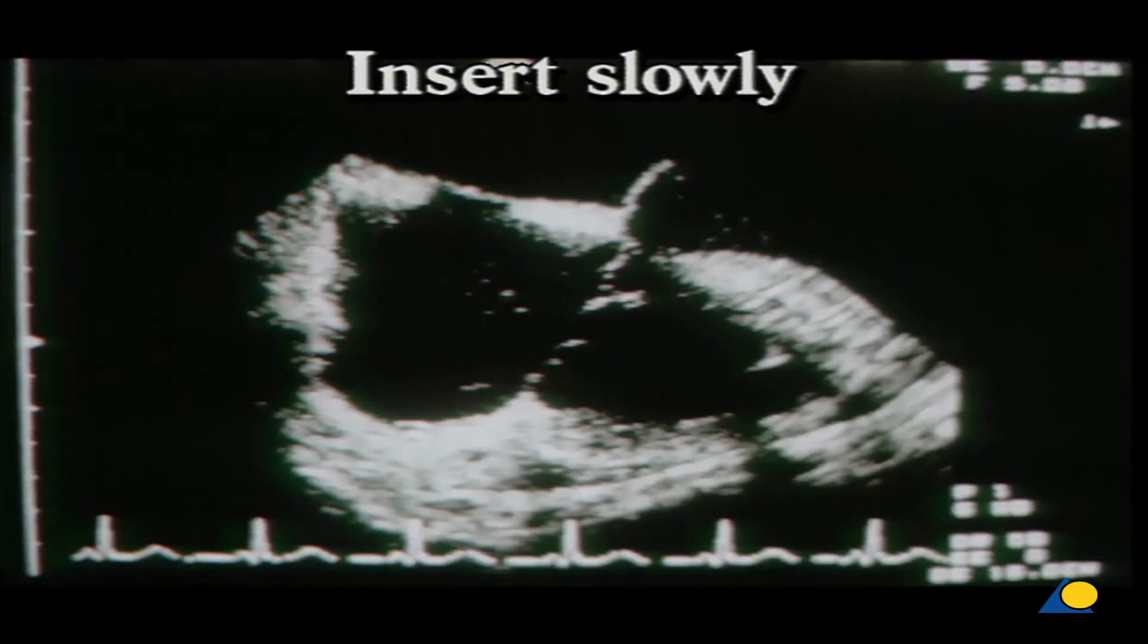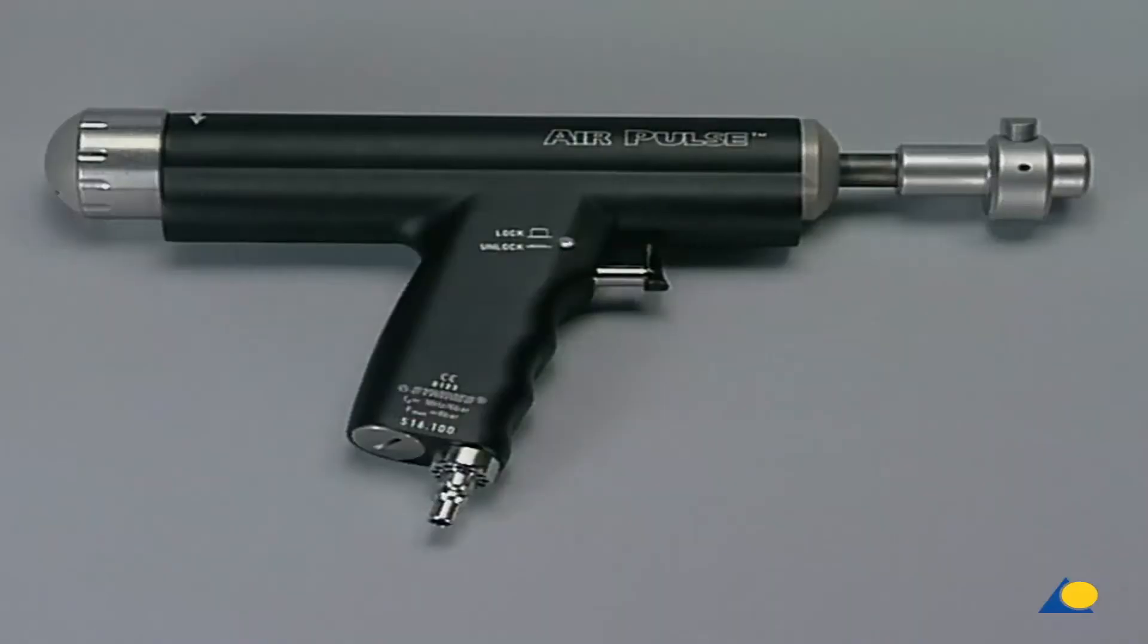When forceful pressure is applied to the air pulse, however, this results in fast advancement of the nail along the medullary canal and an increase of infiltrations. But when the air pulse is used with care, it allows gentle insertion of medullary nails with minimum risk of embolization of the local vascular system and minimum general infiltration of particles from the medullary canal. Thanks to its limited impulses, it's also easy on the nearby joints.